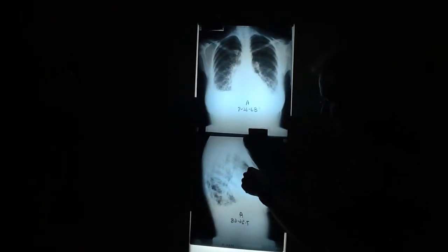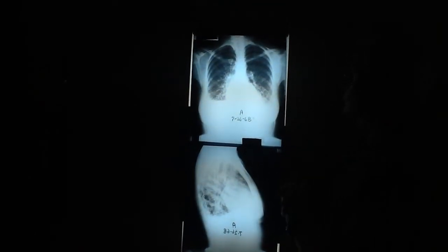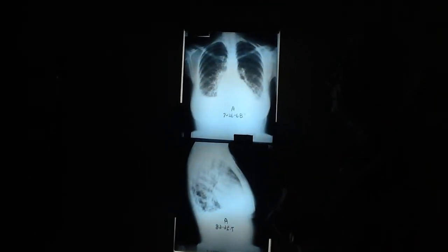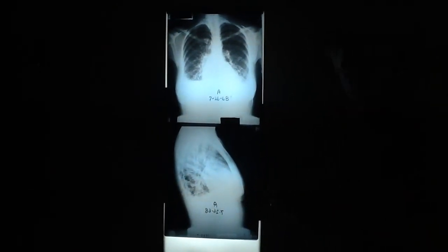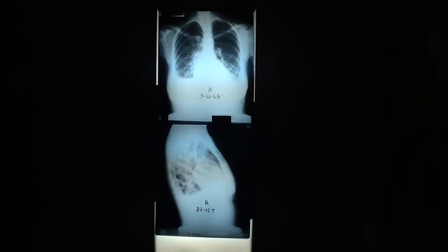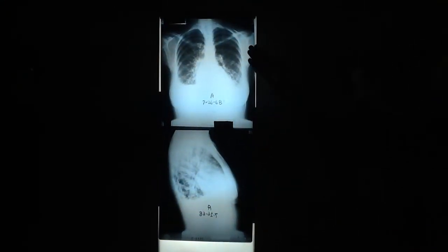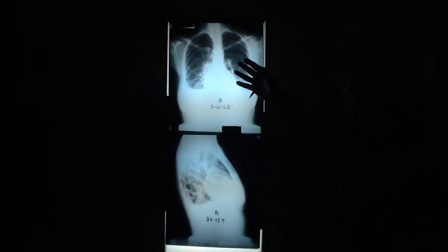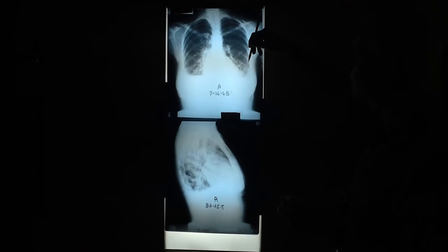Remember, right behind the sternum is another good area. And of course, Curley described these back in the 1930s. And although he described 3 sets of lines, the best ones for looking at are the B lines, aren't they? Those are the easiest ones to look for. They're out near the chest wall. A lines are too difficult to look at. C lines probably don't exist, so we look for the B's.